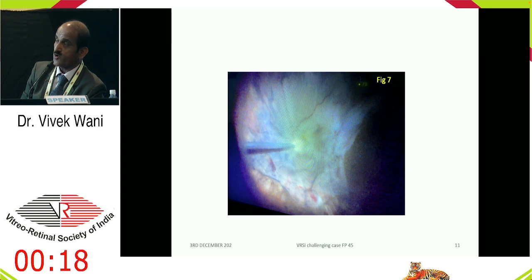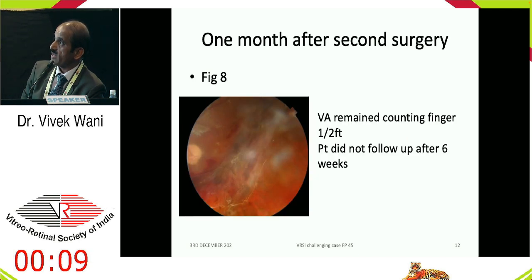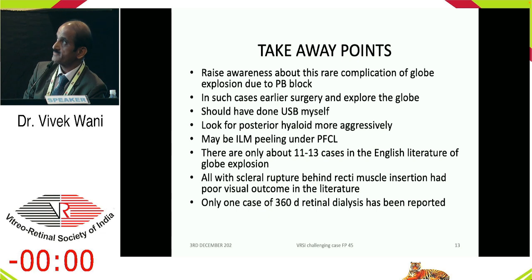This is what we found during surgery. You can see that the retina is crumpled there and inverted on itself outside actually, and some part of the retina is flat. One month after surgery, there was partially attached retina with silicone oil, and the vision was only counting fingers half foot. The patient did not follow up after 6 weeks.